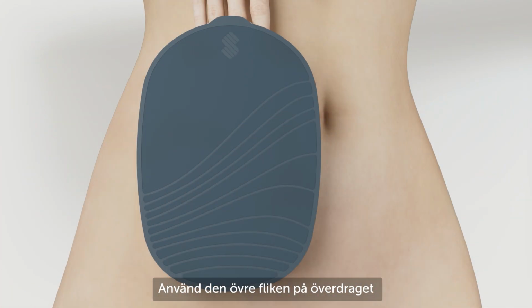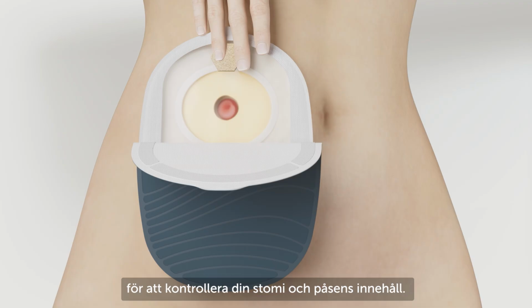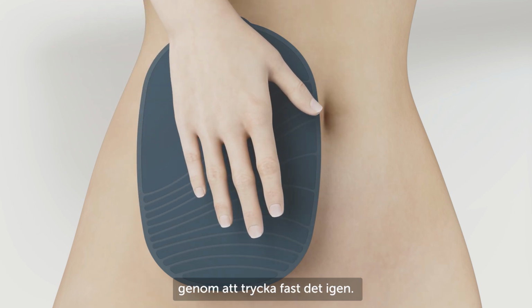Using the cover release tab at the top of the bag, half peel the cover off from the top down to have a view of your stoma and output. Then, just return the cover to its original position by pressing the cover securely back in place.